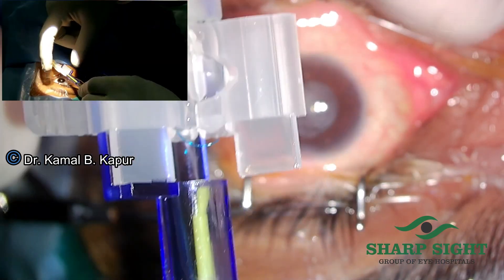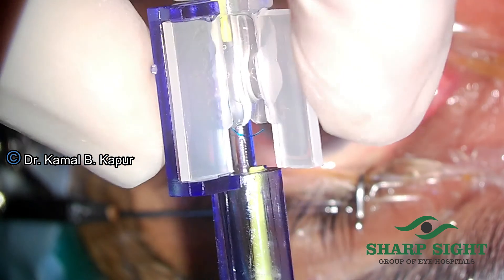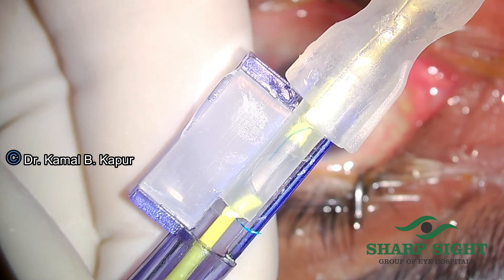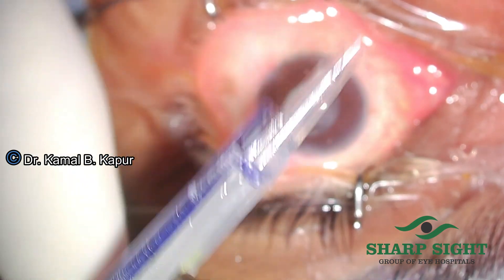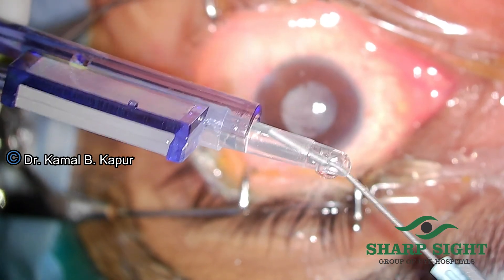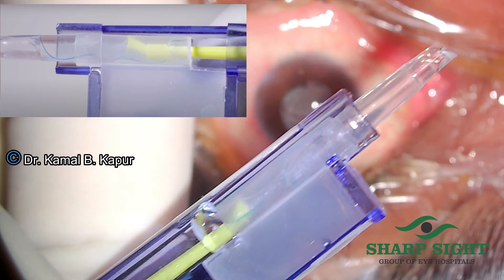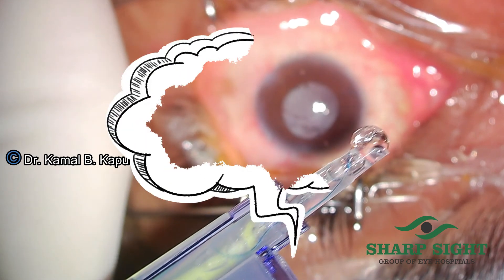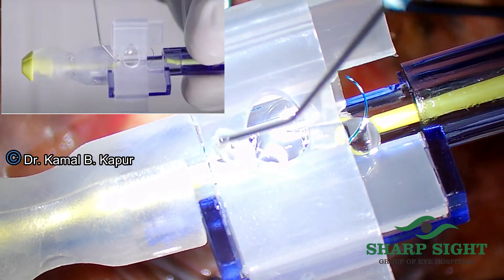Once the viscoelastic has been placed, we pinch the lock over the cartridge wings and slowly remove the lock. Having done that, we close the wings of the cartridge — sometimes these wings may not close easily and may need some pressure. After that, we remove the cap on the cartridge. We then put some viscoelastic into the cartridge tunnel to facilitate travel of the IOL loop into the cartridge. We make sure that the trailing loop still stands out of the cartridge, then slowly and gently inject the cartridge plunger and see the loop coming out of the tunnel in a straight manner.